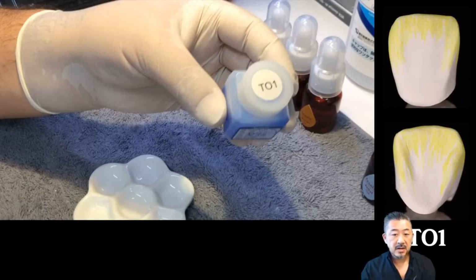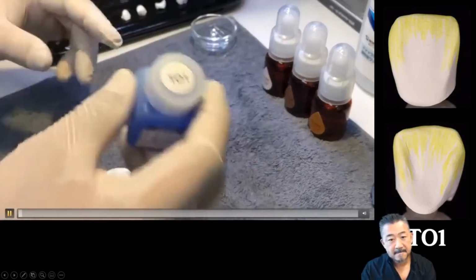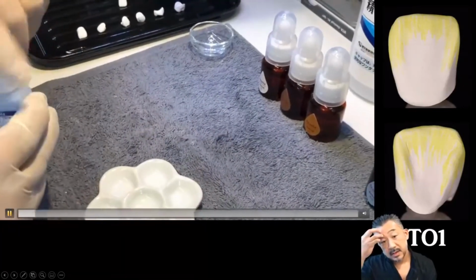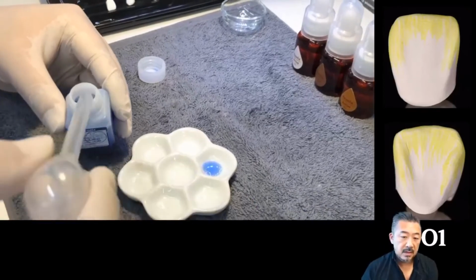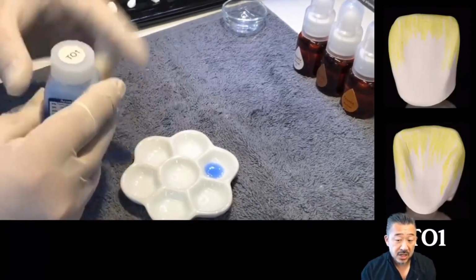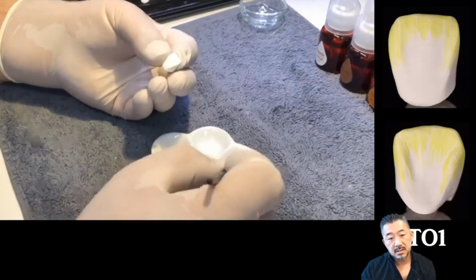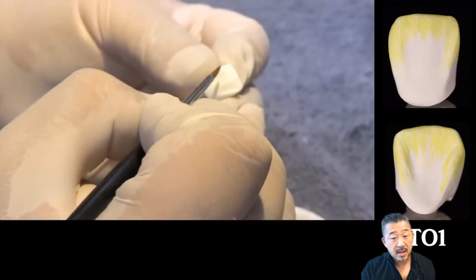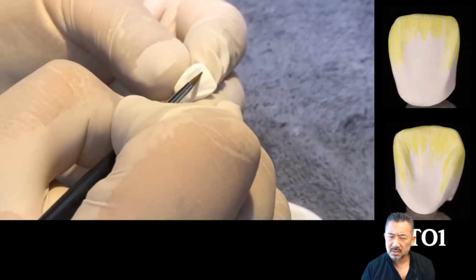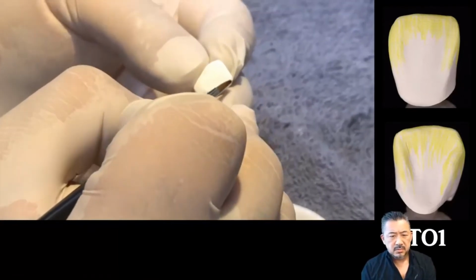So now I'll explain how to apply the sintering liquid. Please apply the liquids for the incisor. Be sure to check each liquid well before putting it on the palette. The first is T01. This wasn't on the list above, I don't know why.